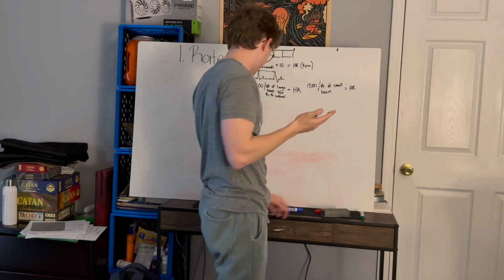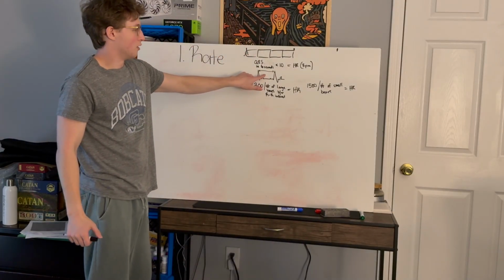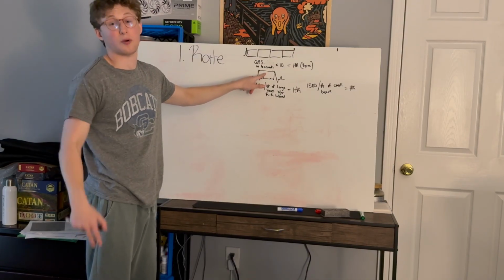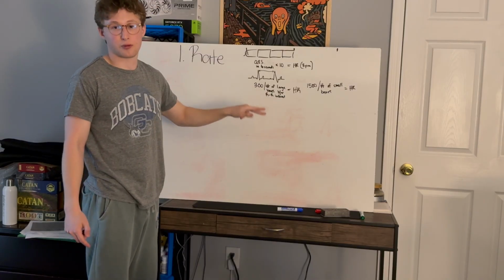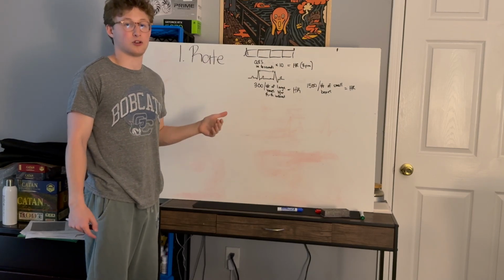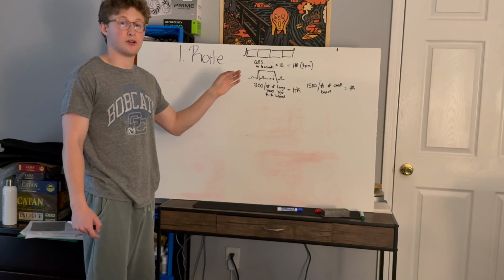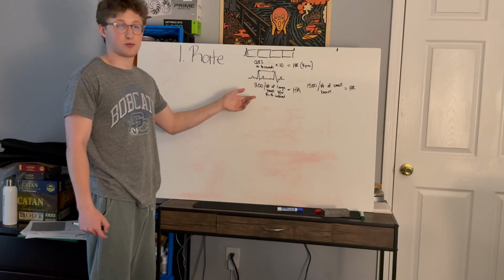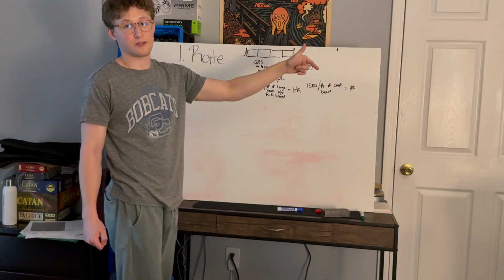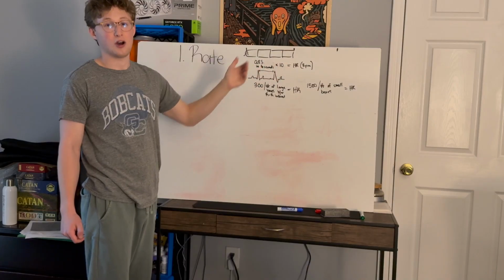Just for an example, let's say the number of large boxes was 3. So 300 divided by 3, the number of large boxes between our R to R interval, is 3 large boxes. 300 divided by 3, 100 beats per minute. For 1,500, let's say it was 3 large boxes. That's 15 small boxes. Again, 1,500 divided by 15 small boxes, 100 beats per minute.